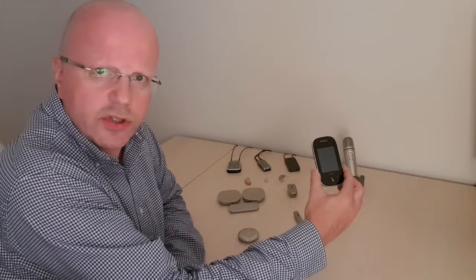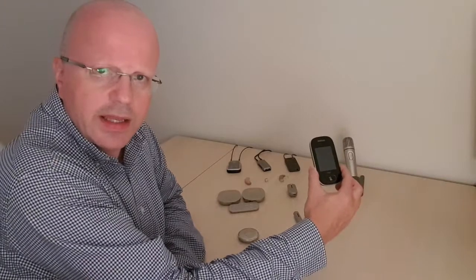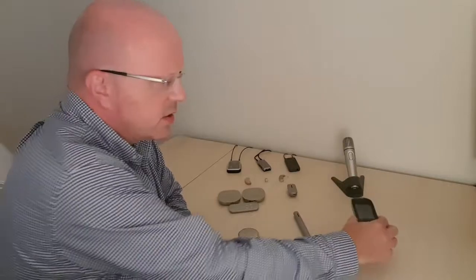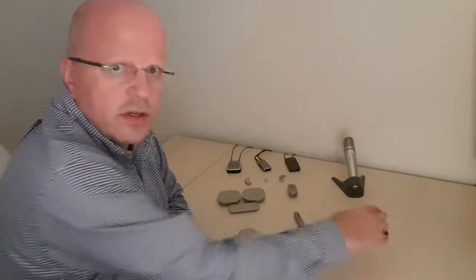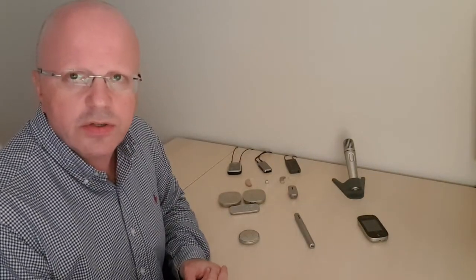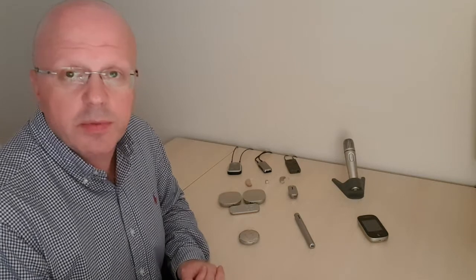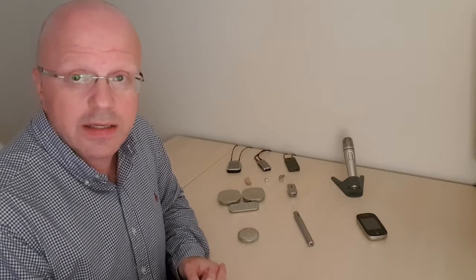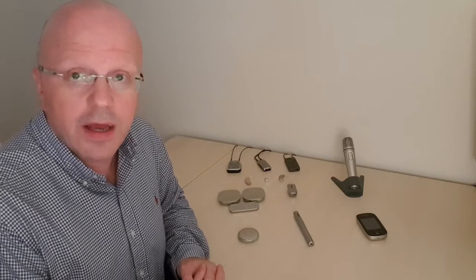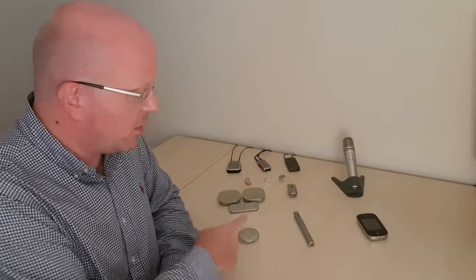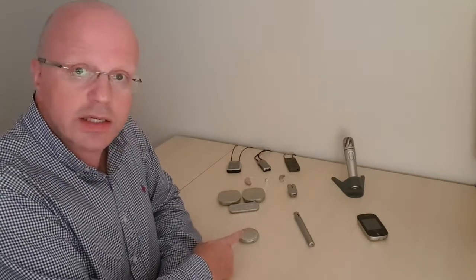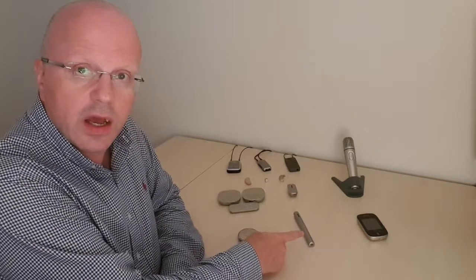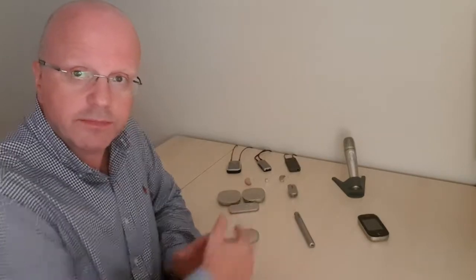We don't tend to supply a lot of touchscreen mics. They tend to be supplied mainly in educational situations, and as an organization we supply mainly to the workplace and also to members of the public. But the touchscreen mic is a good transmitter, and in its place it works very well. We concentrate mainly on the Roger Select and on the Roger Pen.